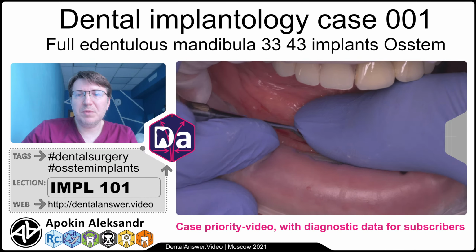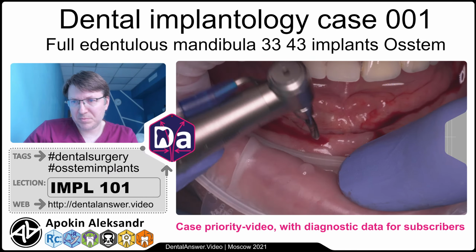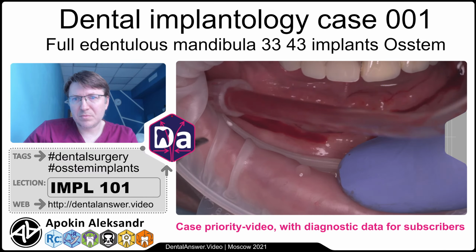Today we also use a very fresh video without any cut process, without pre-processing. This is just from the camera. And now we choose the pilot drill.